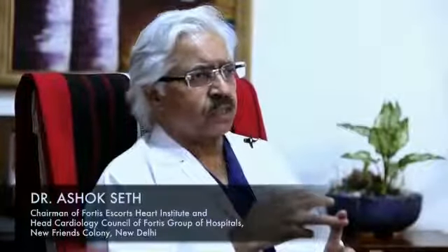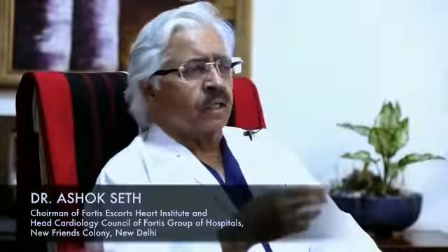It's very regular that we come across heavily calcified lesions which have to be either rotablated or treated with high pressure balloon dilatations to get the optimal result. And it's well recognized that unless we treat these in the most optimal manner to get the largest lumen, we have a greater chance of stent thrombosis and also restenosis. So, adverse outcomes.